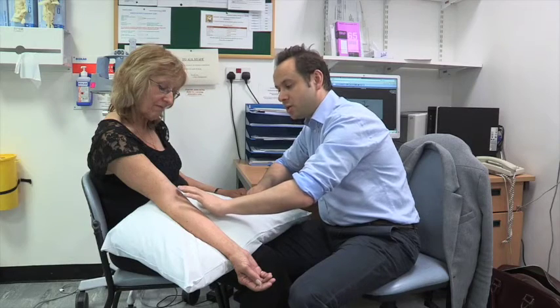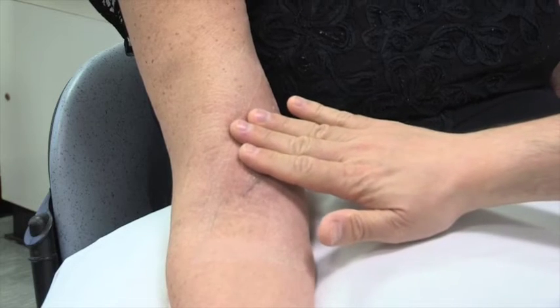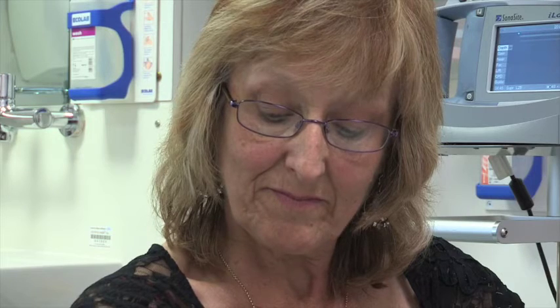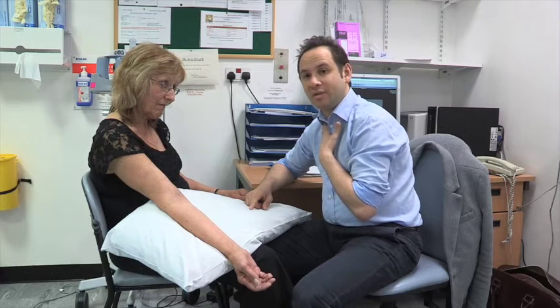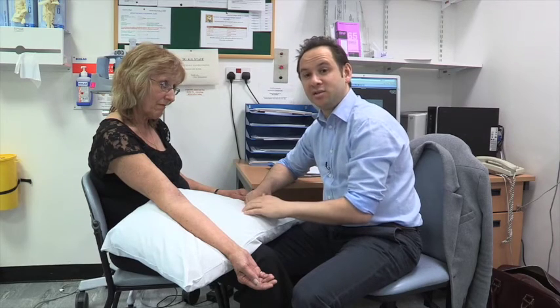This was the scar for the second stage operation to elevate the fistula. If you feel along here, the fistula is buzzing away nicely. This is not far off from being needled, which means that Valerie can start her dialysis without using a central venous catheter. She's got the fistula here ready and waiting for her, and that is the ideal situation.